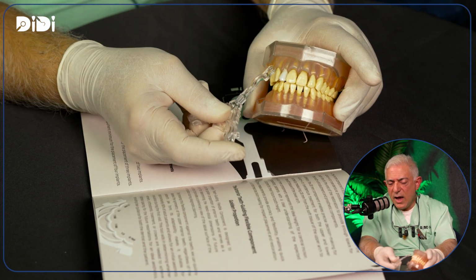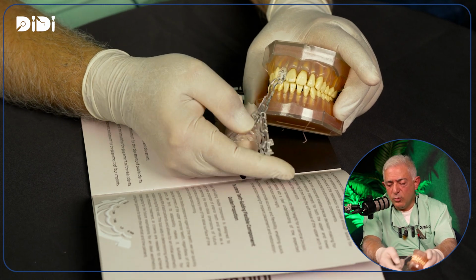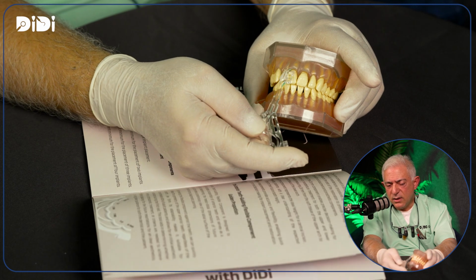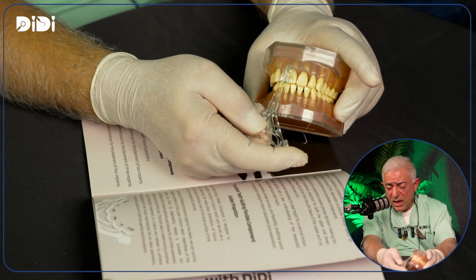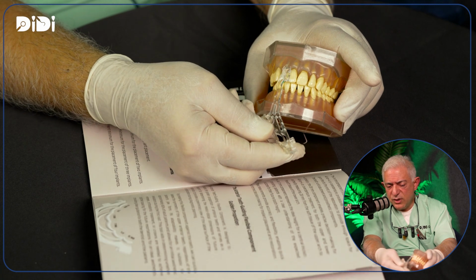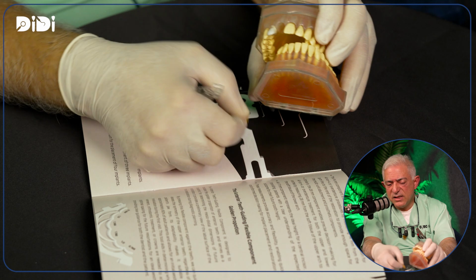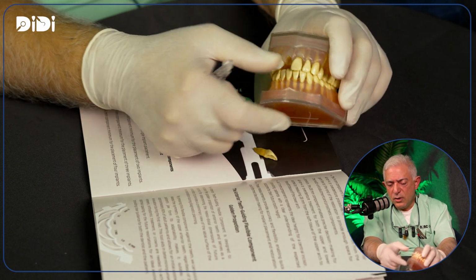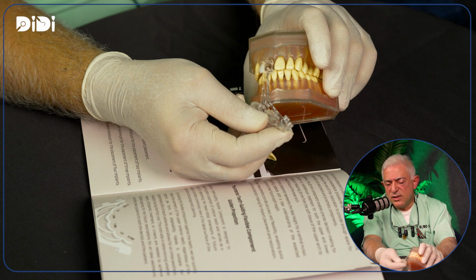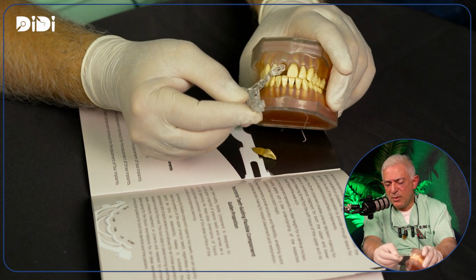So then you have a starting golden proportion formula in your head. So if this is 11, you might be able to do that with a ruler or caliper, but this is in front of you. If you put this on top and you have 11 millimeters, it's very easy for you to visualize the crown. Mesiodistally it is 7 millimeters. The shape is curved as the shape of the gingiva.